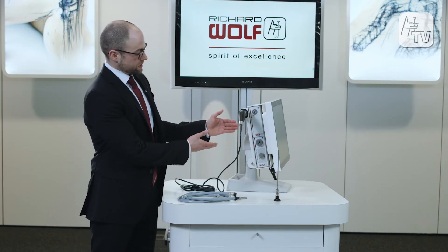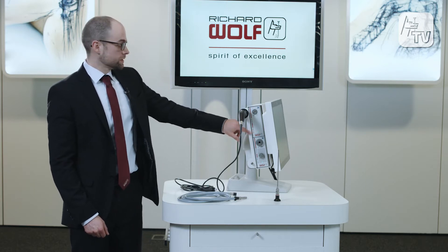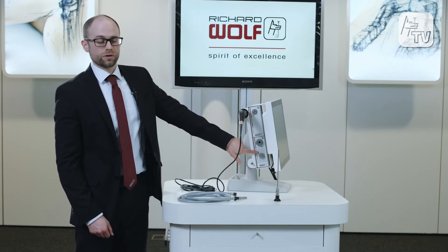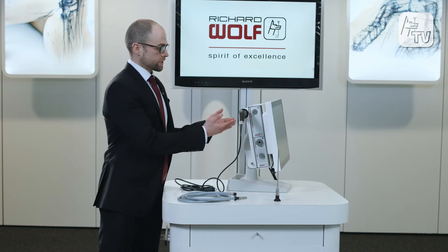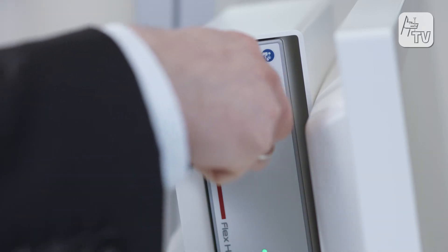The unit is comprised of the controller and the light source. First, the controller features easy plug-and-play operation.